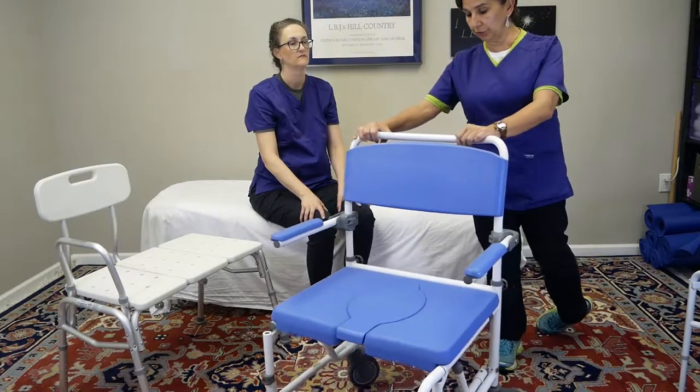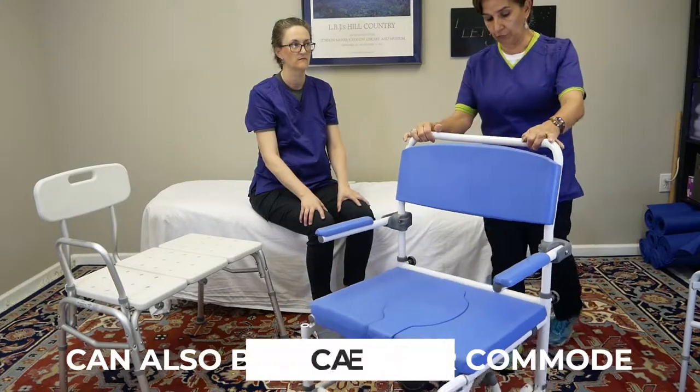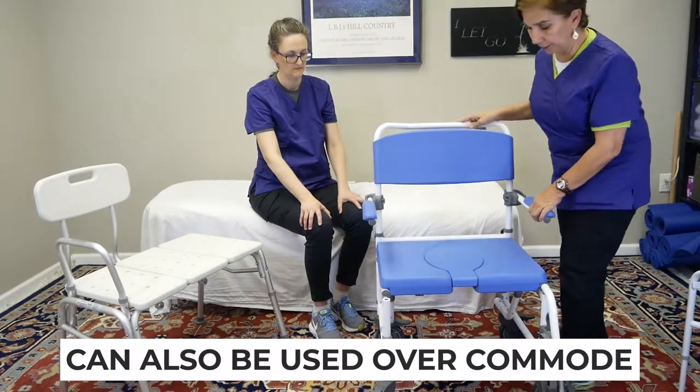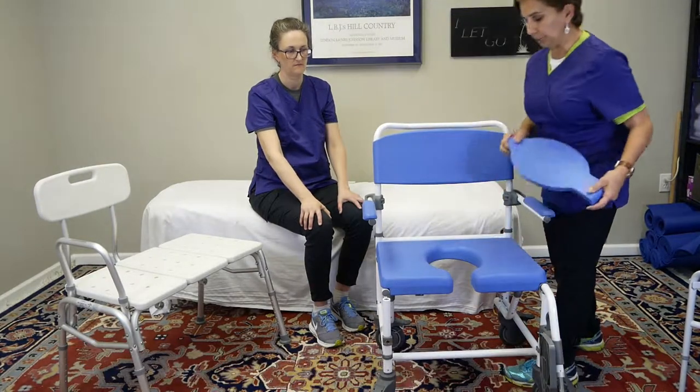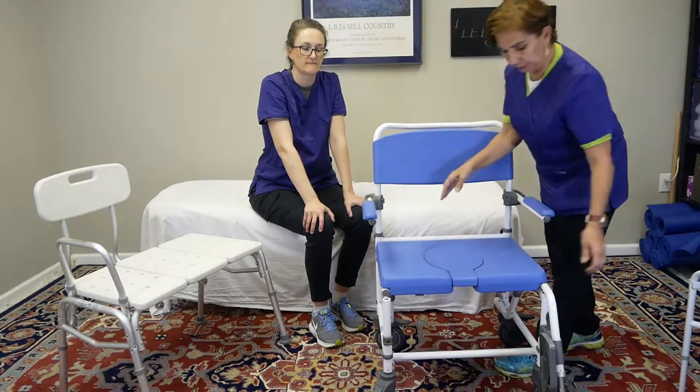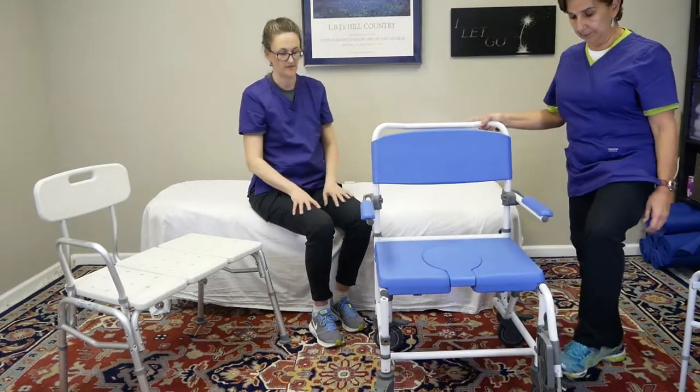You do need a roll-in shower to use this chair. You can also use it over the commode — it has brakes, which is really nice. There's also a removable section so it can be used over the toilet. It's very convenient, very safe, and very sturdy.